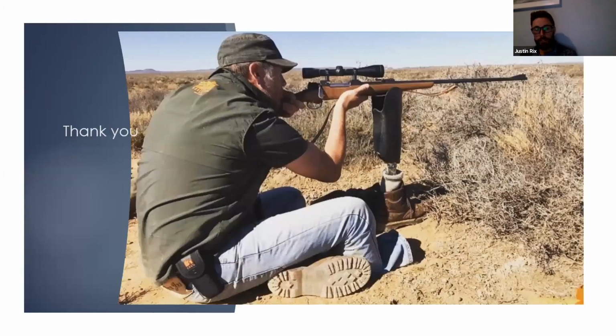So this is actually a patient. He was involved in a road traffic accident, and the surgeon discussed the residual limb length with Jason, and we worked out what would give him the optimum length of his leg at the level of the amputation, so as to fit in all the components below. He's a cyclist, and he enjoys his hunting, and he uses his leg for various purposes, as you can see.